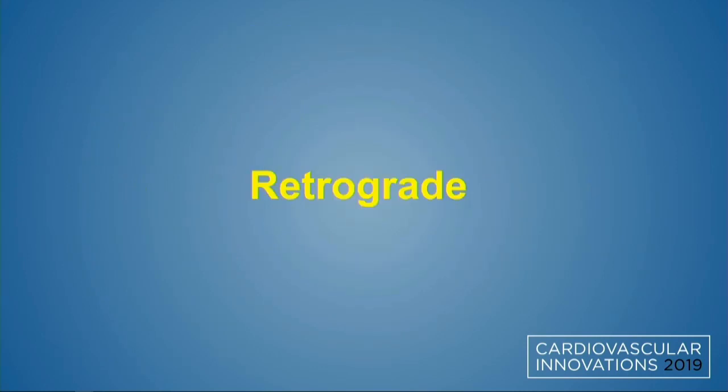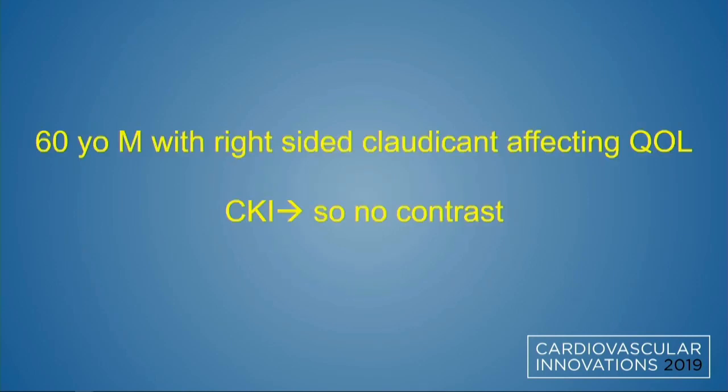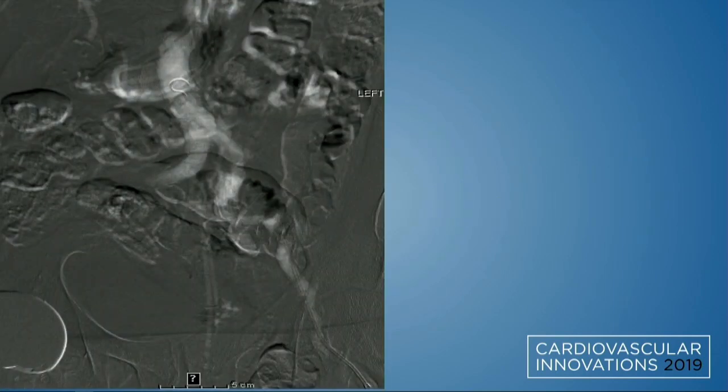So in most cases for those iliac CTOs, retrograde for me is the first option. It's your average patient; the ABIs, everything was evaluated, stress studies. And of course, half of my patients are CO2 because in the Midwest, they all have some level of kidney disease. So it's a nice, beautiful CO2 angiogram, which everybody loves. You see the occlusion on the right side, common, external and internal, on the initial picture. So we have a long length of occlusion.